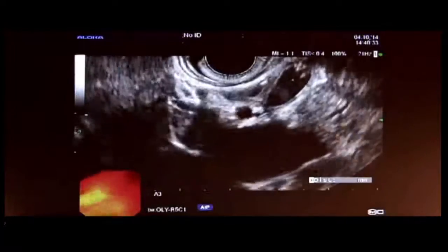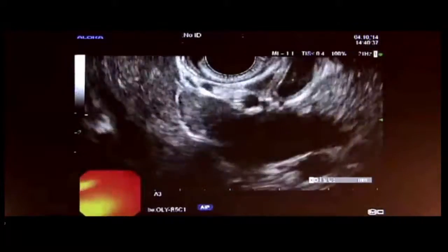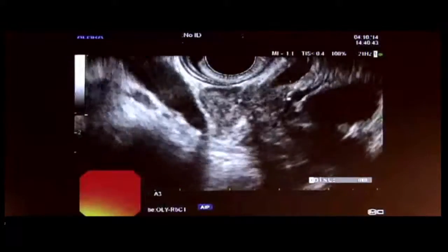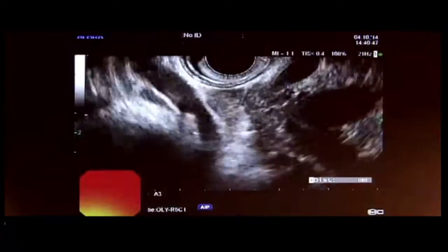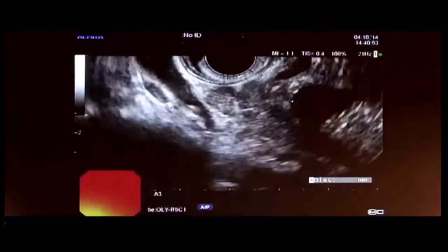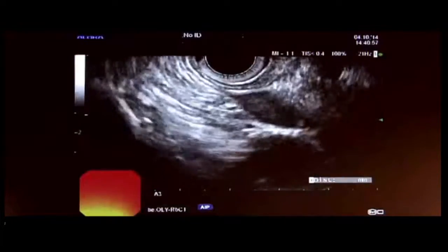So previously I was up at the hilum. On the left-hand side, you can see there's a lymph node there. All looks very benign. The portal vein is deep, and now I'm moving back towards the papilla, and now you see the PD. Interestingly, here the PD is not dilated. It's actually very thin. Looks quite normal. So if I just turn it a little bit more towards the papilla, this is now the area of the papilla.